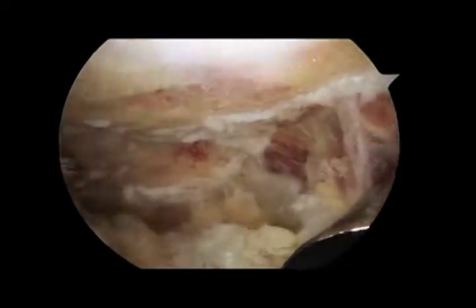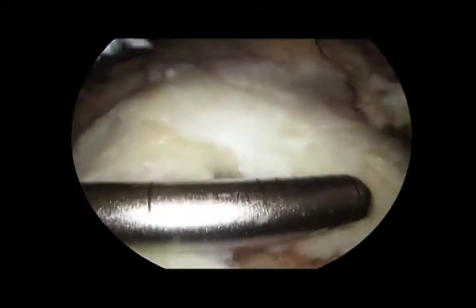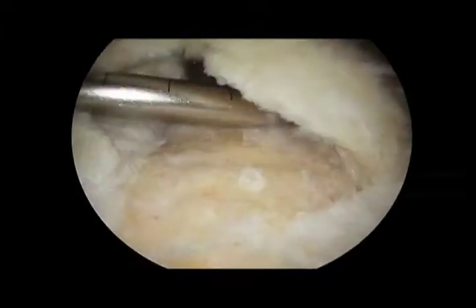With our decompression completed, we now turn our attention to the rotator cuff. After debriding the degenerative and frayed edges of the cuff back to healthy and more robust tissue, we decorticate the footprint on the greater tuberosity to prepare an appropriate healing environment.